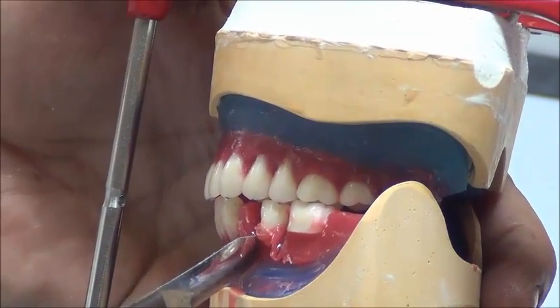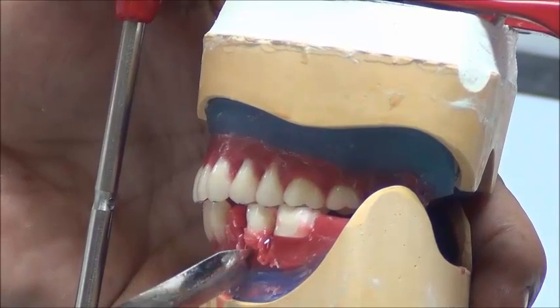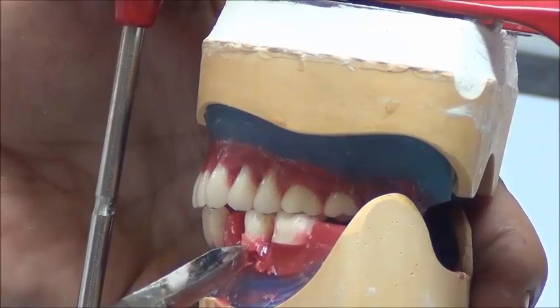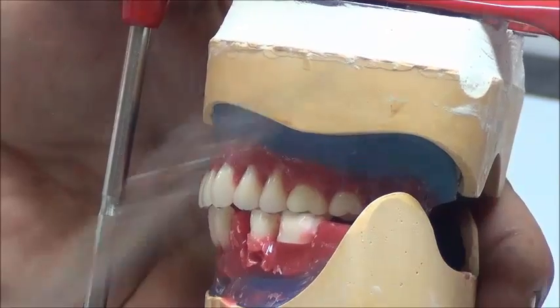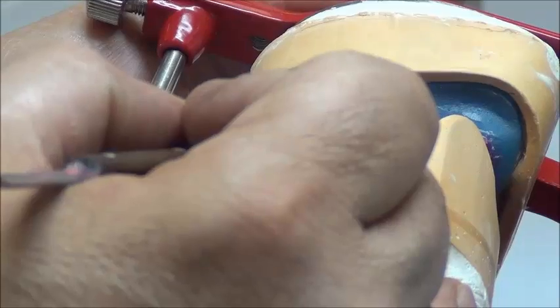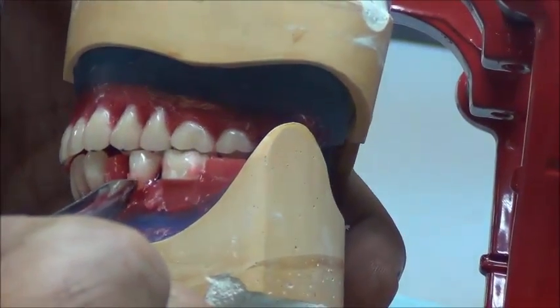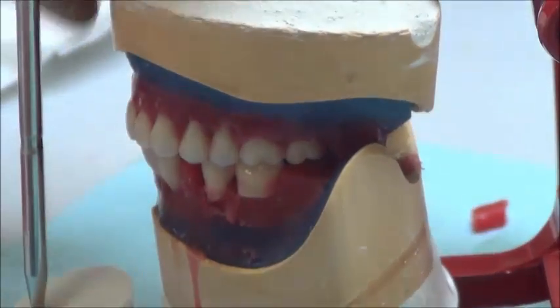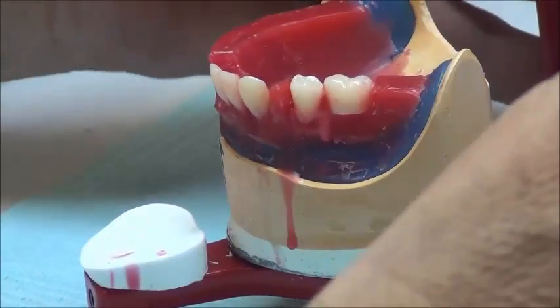Now in the case that you're setting for patients, the selection of the size of the teeth is important, so you select a size suitable for the patient. The tooth that sometimes could have a problem while setting is tooth number 4. After adding tooth number 6 and 5 from the back and the canine from the front, sometimes we don't have space for tooth number 4, so it's the most common tooth that we trim to make it a bit narrower.